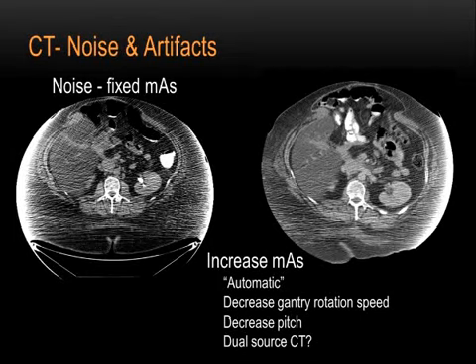They're already perhaps touching or encroaching on the aperture. But if there is wiggle room, you should try to shift and bring the region of interest to the center so that A, you have less effect from the artifacts, and B, you can actually help improve the image quality. In these two images, we didn't change anything except that we just pushed the patient to the other side.